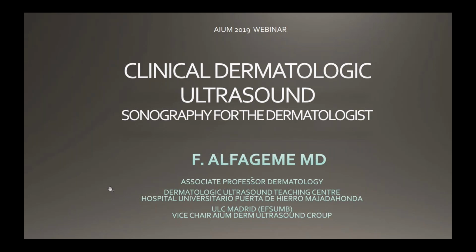The title of the seminar today is Clinical Dermatology. What can we do with ultrasound, and what can we offer to our dermatologists so that they require our services, and how can we convince dermatologists to start requesting ultrasound, given the utility ultrasound may have for them. As I am a dermatologist, I can tell you more or less what we require.